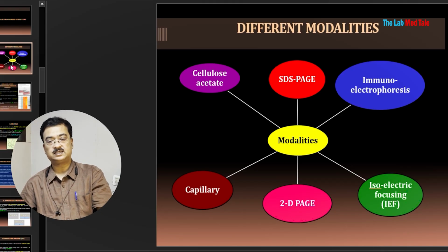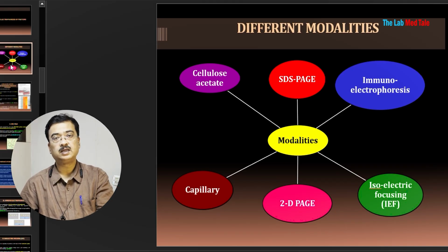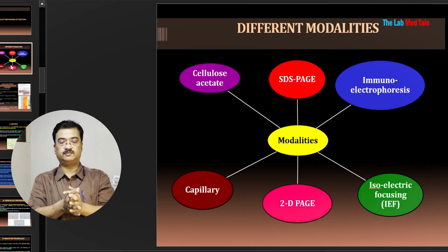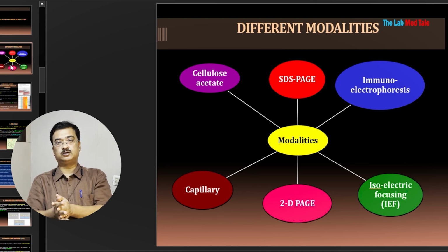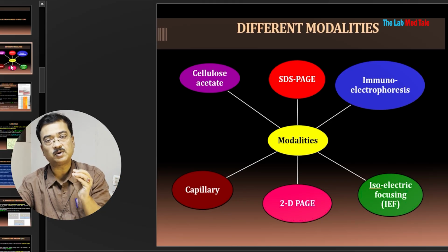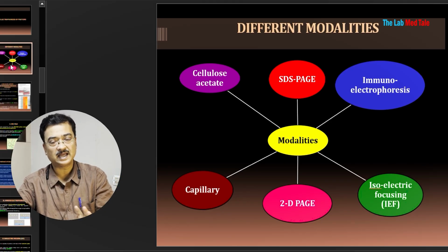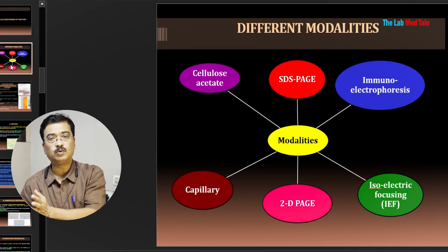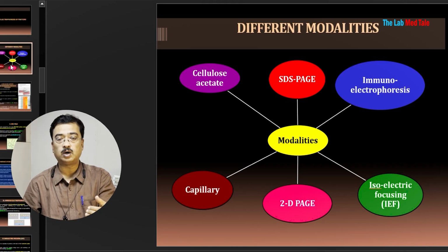First, as I said, Tiselius did it on a liquid base. After that, it was found that this kind of electrophoresis can also be done on a paper. So there is paper electrophoresis. But the major problem with paper electrophoresis is that the separated molecules diffuse very widely and could not be visible very clearly. Therefore, the medium has changed and evolved one after another, making the electrophoresis pattern more and more sophisticated and easy to operate.